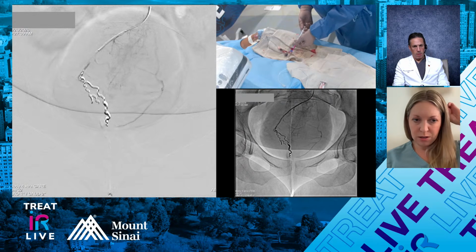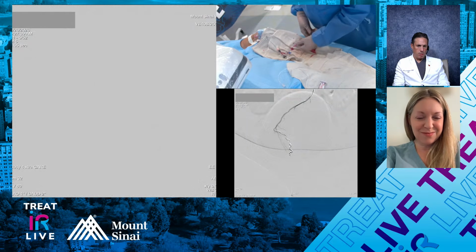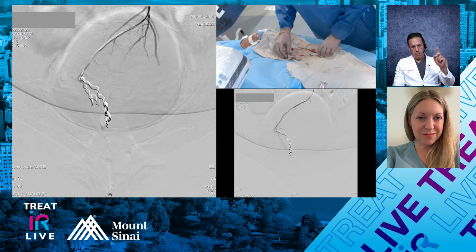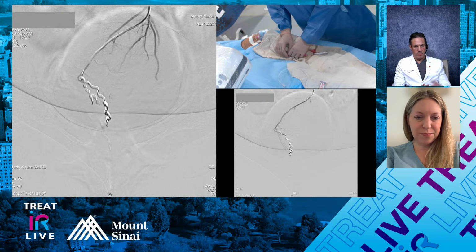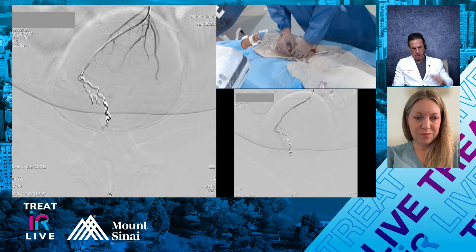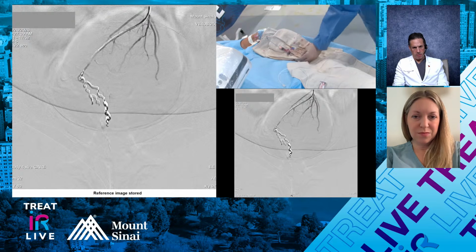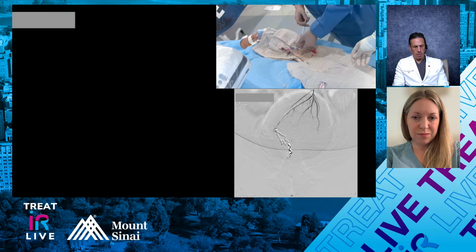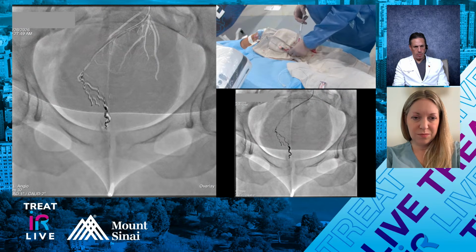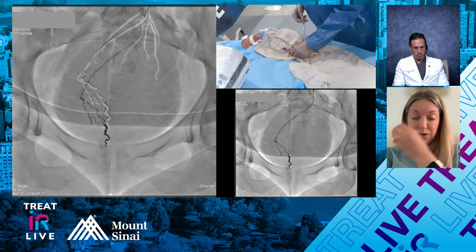Looks great. Nice. That's fantastic. Now we kind of see where we have to go on the other side too, right? Yep. So let us do that. I like to do the run at the bifurcation of the rectal, sort of at the top. You obviously did a great job on that side. But what I typically do is I go up to the bifurcation and just do a more aggressive run, so I can see. You can already see that there's a rectal going down there that you're going to probably want to embolize, but there may be a third or fourth. I'm pulling back a little bit and I'll do another run up higher like you started saying. I'm doing some power runs from right before that bifurcation through the micro too, which have been nice.